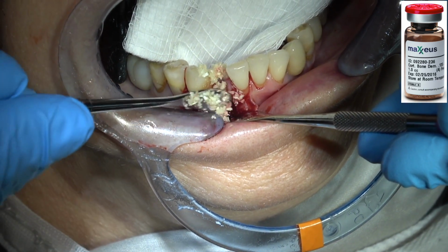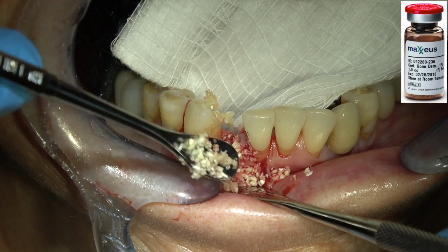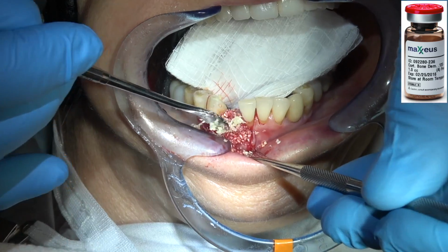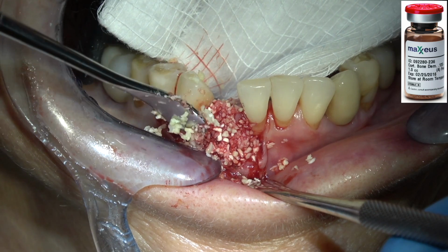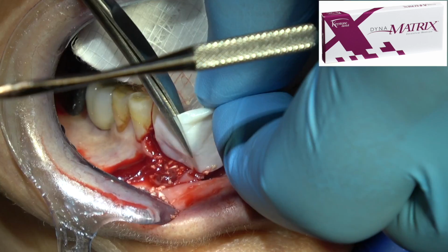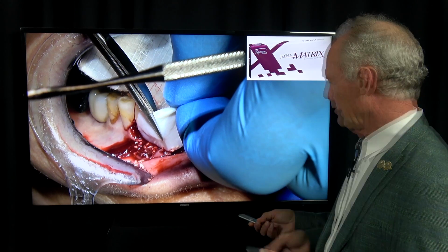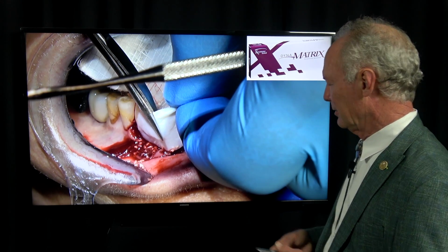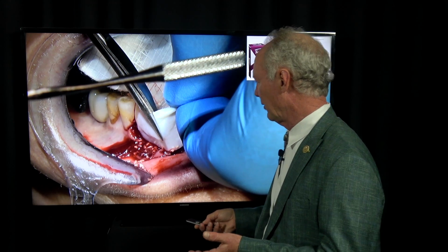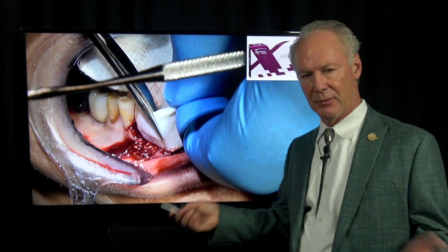So this is freeze-dried bone. I'm going to pack that in the socket. Now, my favorite, if a person has good veins, is to draw blood, spin down platelet-rich fibrin, and mix the platelet-rich fibrin with the freeze-dried bone and use the serum as the wetting agent. You know, platelet-rich fibrin enhances healing. This patient did not have good veins, and so I wasn't able to do that. So I'm using just plain freeze-dried bone, and that works well too.